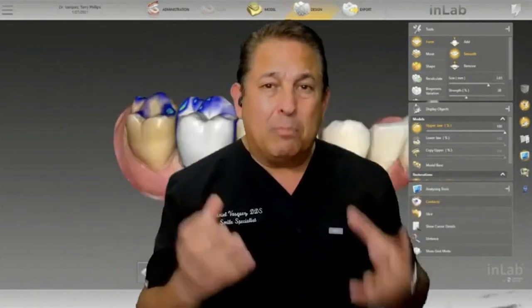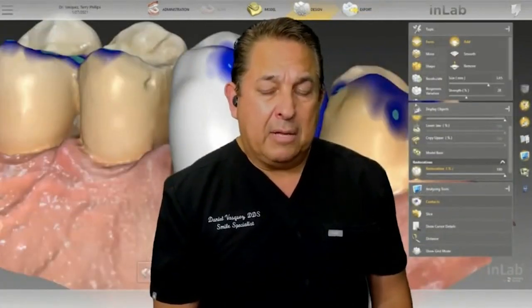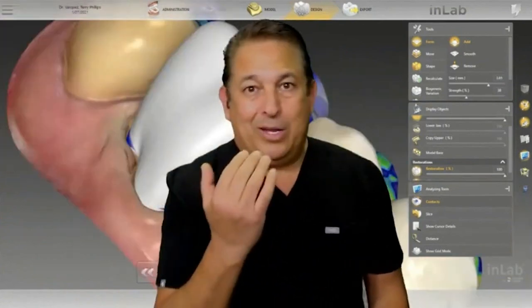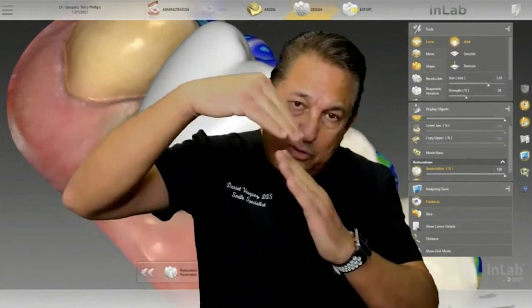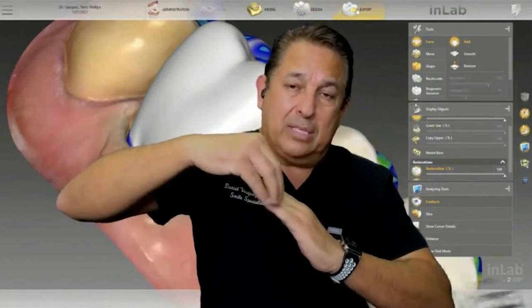And because these are bonded, you know, nothing's going to happen to them. They're not going to break. They're unbreakable. I've been talking about veneers. You know, when we prep veneers, we never make a thick chamfer or a light chamfer. I always try to do a feather edge so my veneers sit perfectly fine on the tooth. We seal it with a composite. We polish it very nicely. And the next thing you see is beautiful soft tissue. The soft tissue heals very nicely around there.